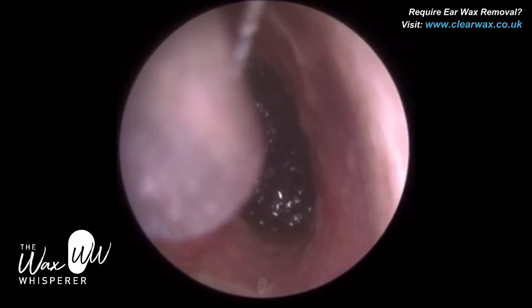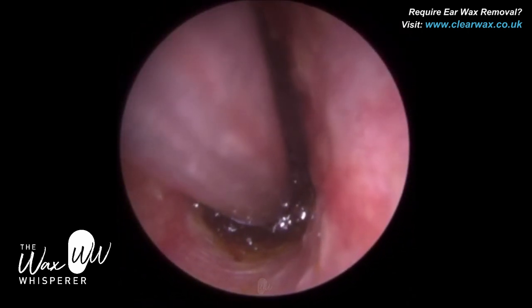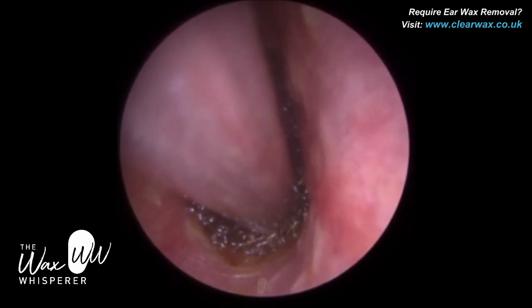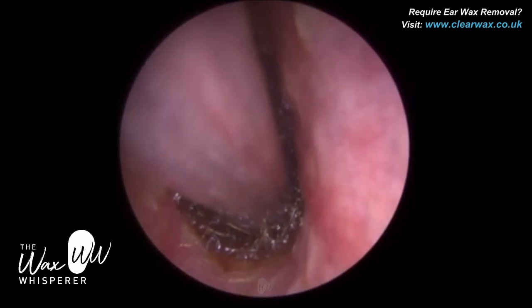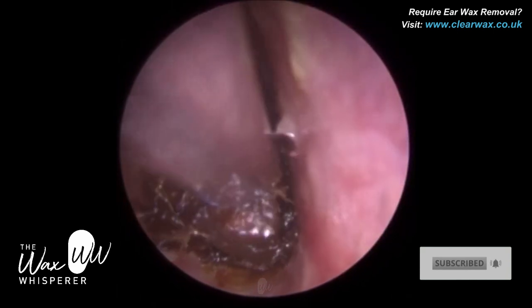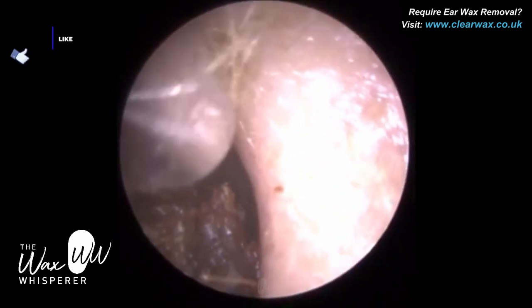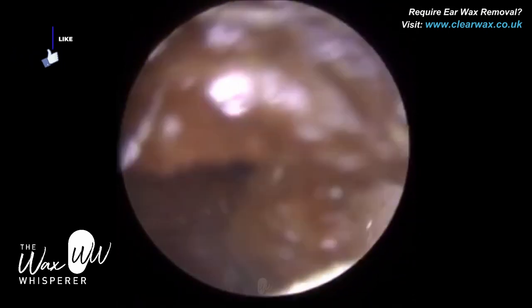We have a patient who had used a Q-tip — we call that a cotton bud in the UK — to try and relieve his blocked ear. But unfortunately, they only managed to further impact this wax right up against the eardrum. So this is really impacted and squashed right up against the eardrum.